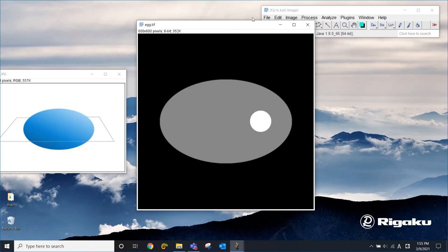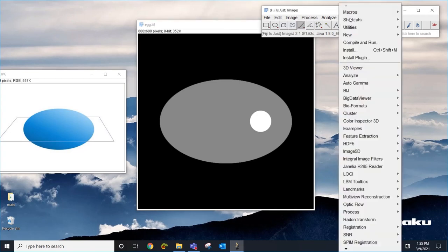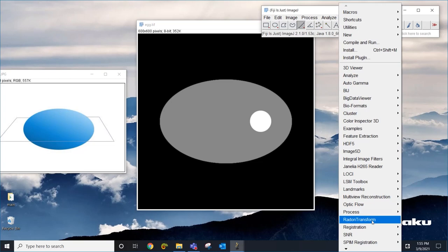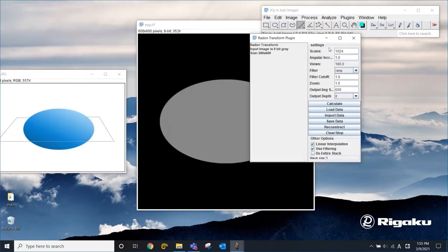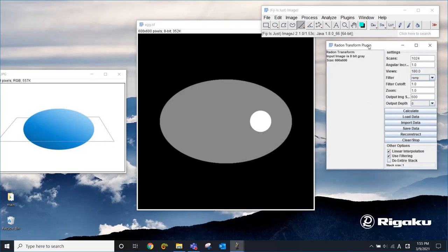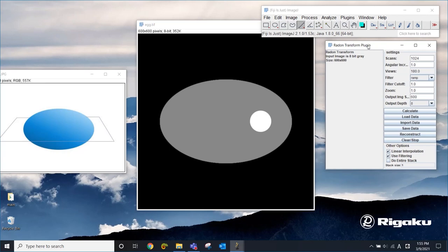To do that I'm going to go to plugins and then go to radon transform. This is an ImageJ plugin and I'm going to put a link in my post so that you can download this plugin and do the same thing. Radon transform is going to help you simulate the X-ray projections.